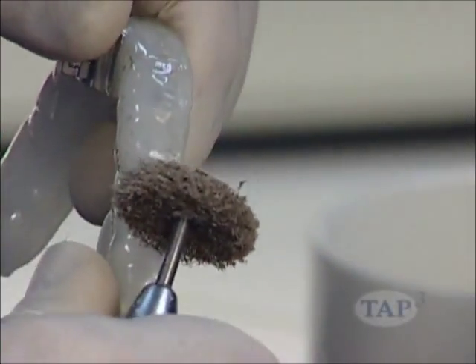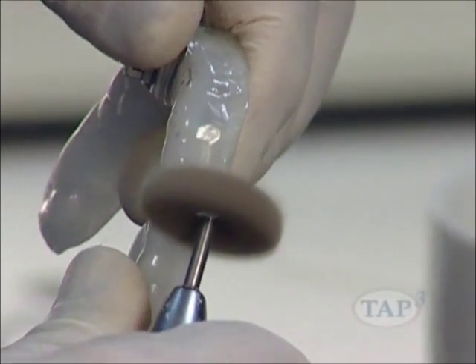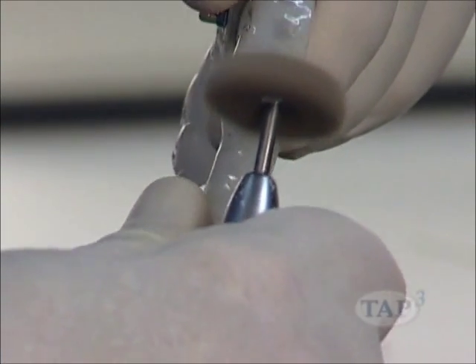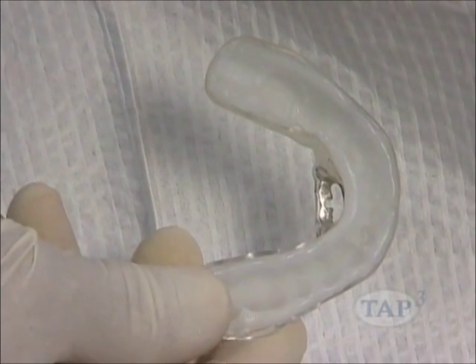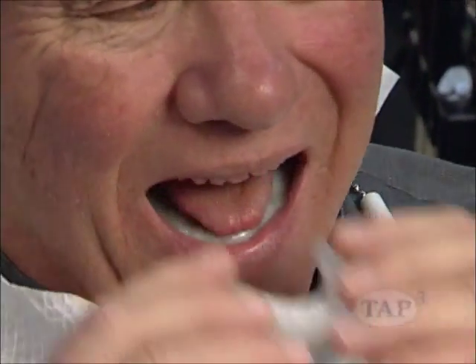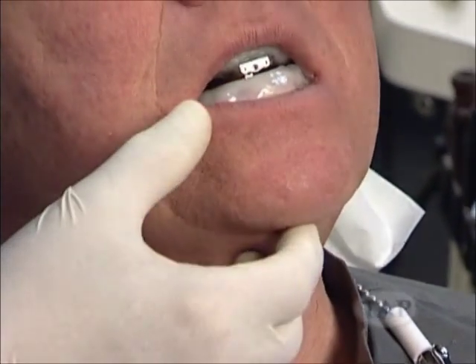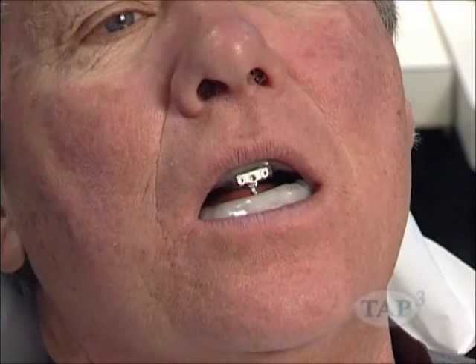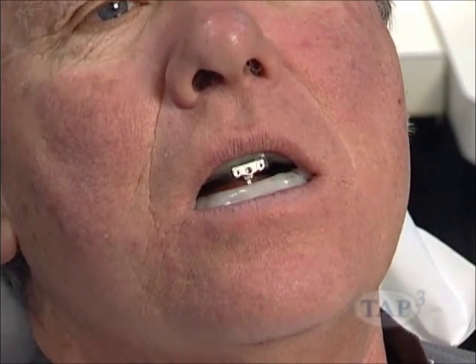Once the tray is seated and comfortable for the patient, polish the flanges with a fiber wheel to remove excess thermocryl. Repeat the fitting process for the lower tray. Once you finish fitting the trays, have the patient place both trays in their mouth. Make sure the trays fit properly. Also, make sure the hardware is in the correct position, can hook together, and function properly.